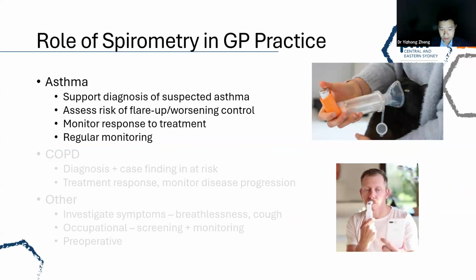Just a quick reminder about the role of spirometry. Along with medical imaging, spirometry is the bread and butter of clinical investigations for pulmonary abnormalities and symptoms. Asthma is a clinical diagnosis, but certain patterns on spirometry help support the diagnosis, such as variability or bronchodilator response.